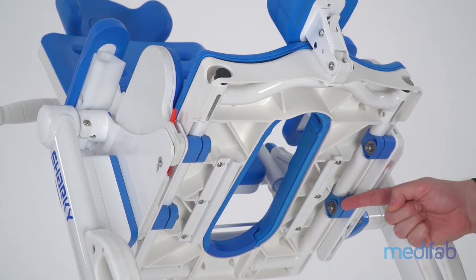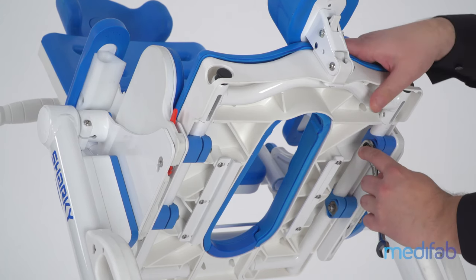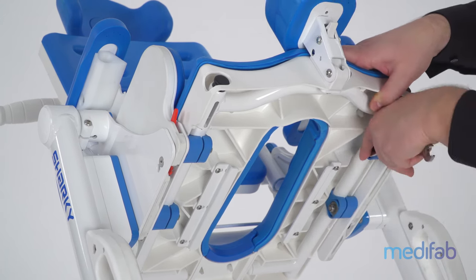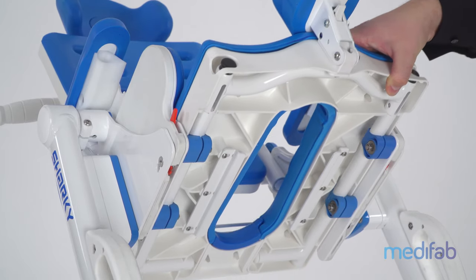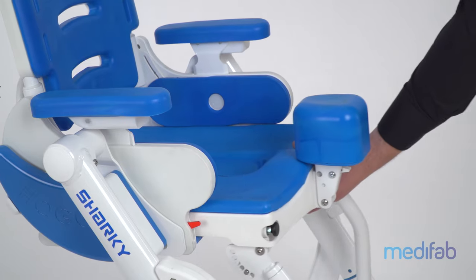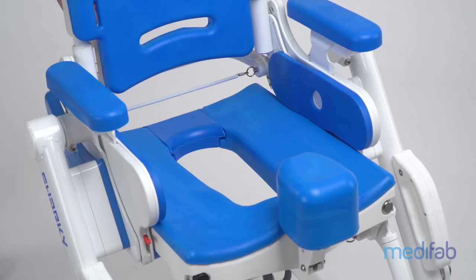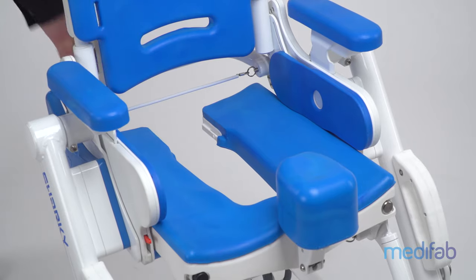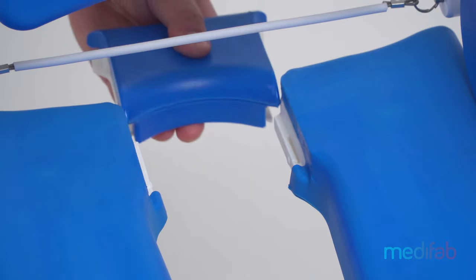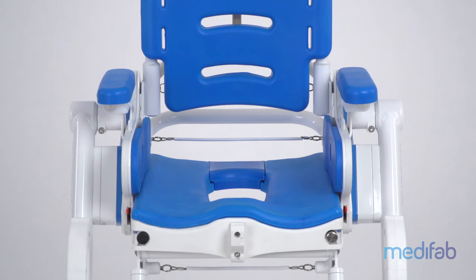To adjust the seat depth, first loosen the nut indicated. The seat can then be adjusted to the individual's needs. The removable insert at the back of the seat is standard equipment and allows quick and easy access for hygiene care. The seat width is adjustable by using different hip pads.